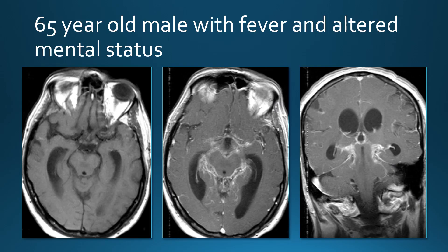This is a 65-year-old man with fever and altered mental status. We see extensive leptomeningeal enhancement along the midbrain and in the suprasellar cistern. This patient also has mild hydrocephalus. This is a patient with tuberculous meningitis.